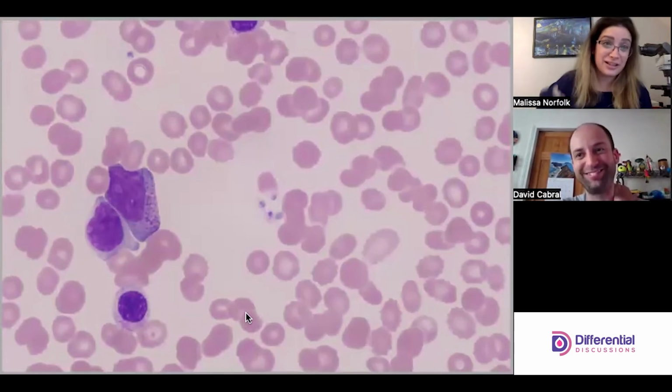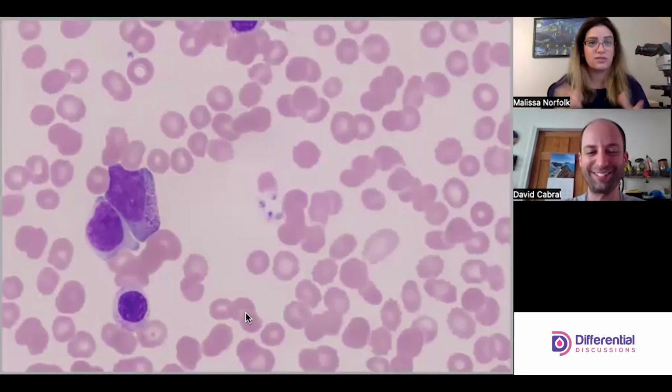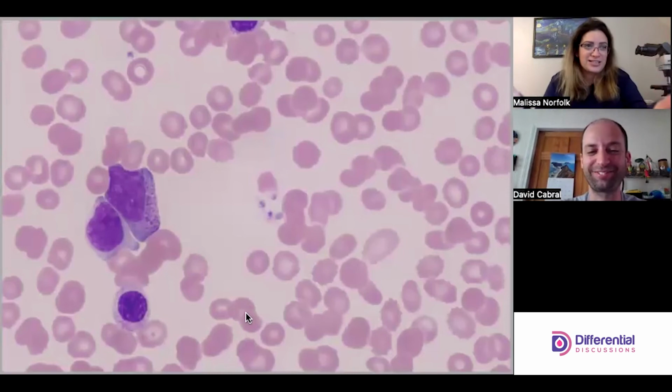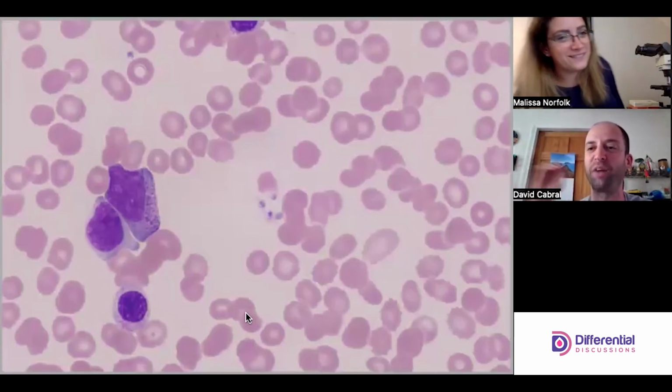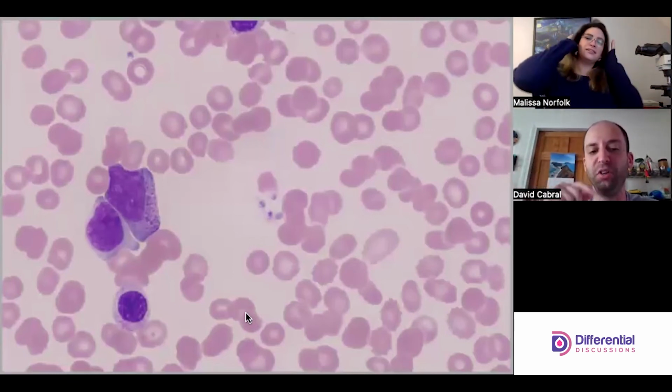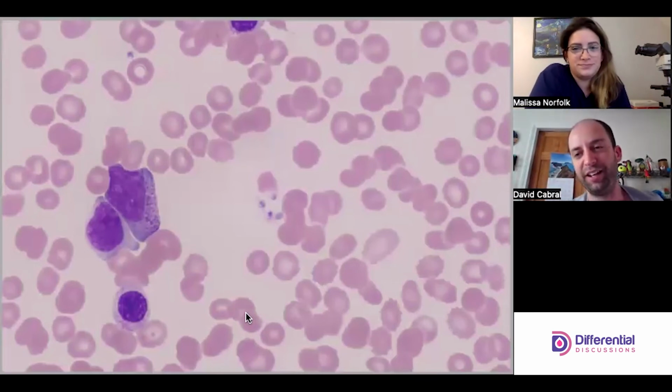I was talking about that the other day to a group of students: when you see a super round nucleus, that's generally more of an NRBC thing. But this guy defies the law. If you flashed the cell in front of me, I'd call it an NRBC 100 times out of 100. But when you look at the cytoplasm, red cells just aren't going to have granulation and grit and stuff like that.